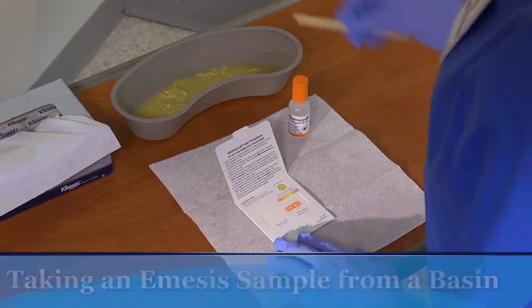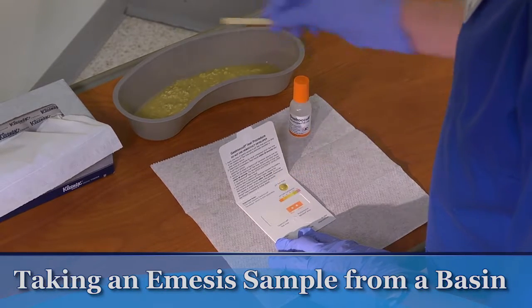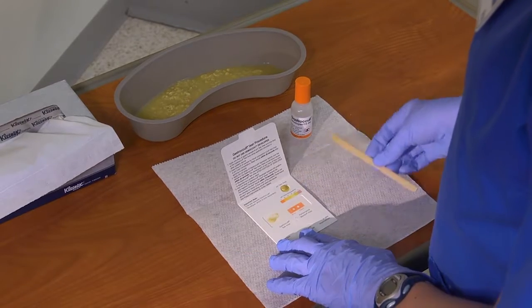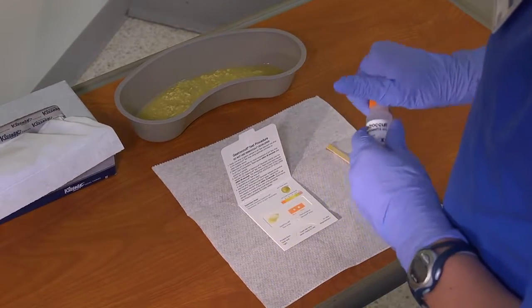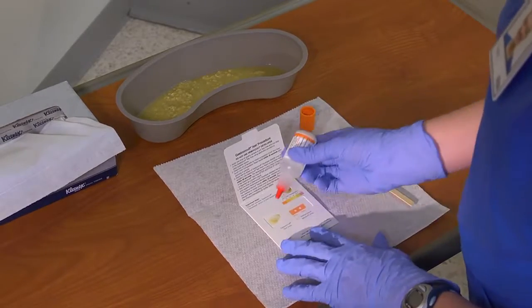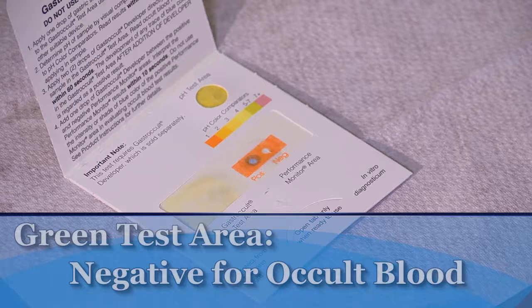To obtain a specimen of the patient's gastric contents from the emesis basin, use a wooden applicator or a 3 milliliter syringe to put it on the test slide and pH test area. Follow the manufacturer's instructions for testing. Again, any trace of blue in the test area is considered positive for occult blood. A green test area means the sample is negative.